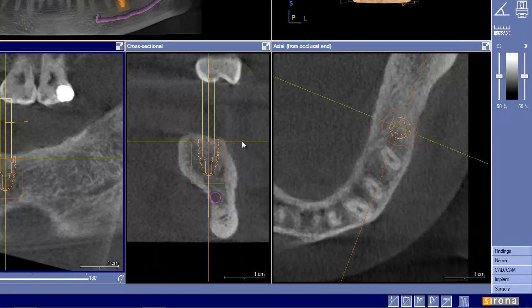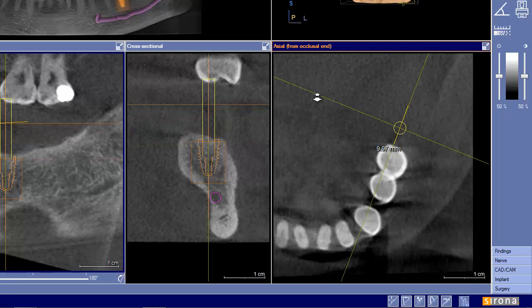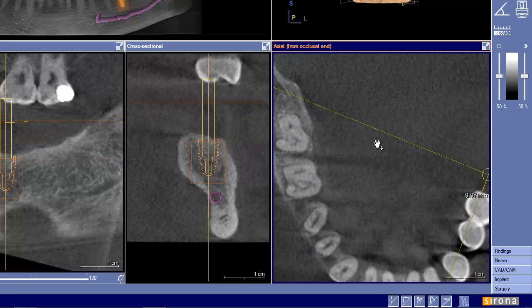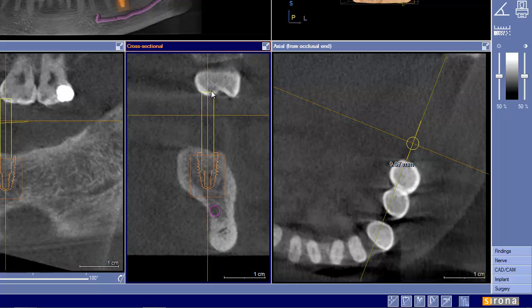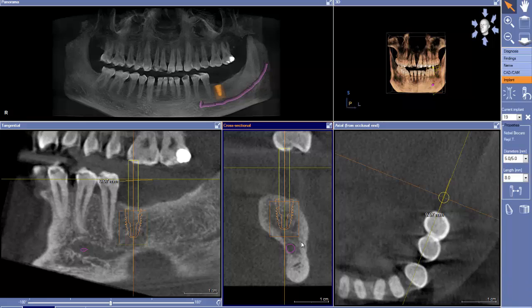Now, based on that, again without having the true data here, my guess is that this implant is centered pretty nicely. We can hesitantly use the upper lingual cusp as a guideline and see that this implant is probably placed in the right position, based on the fact that we have a big anatomical submandibular lingual area here, a lingual concavity here. I would say we could certainly consider putting a 10 millimeter implant in. That would be my ideal preference.